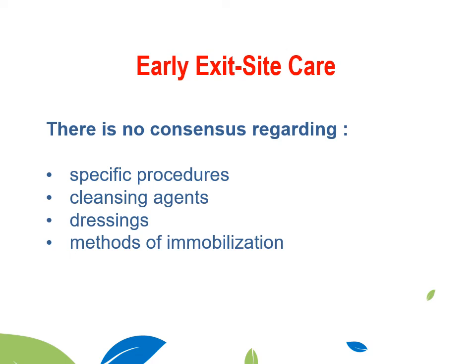Regarding the exit site of the catheter, where the catheter leaves out the tummy, actually there is no consensus regarding specific procedure, cleansing agent, dressings, and methods of immobilization. Actually, this is center experience and depends on the physician's opinion.